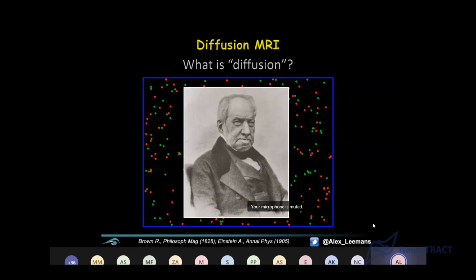Overall, there's a fluid, and there might be some convection going on, like big chunks of the water in a glass moving around slowly. But at the microscopic level, you'll see all these molecules quickly moving around in an erratic way, and then they spread as a global effect.